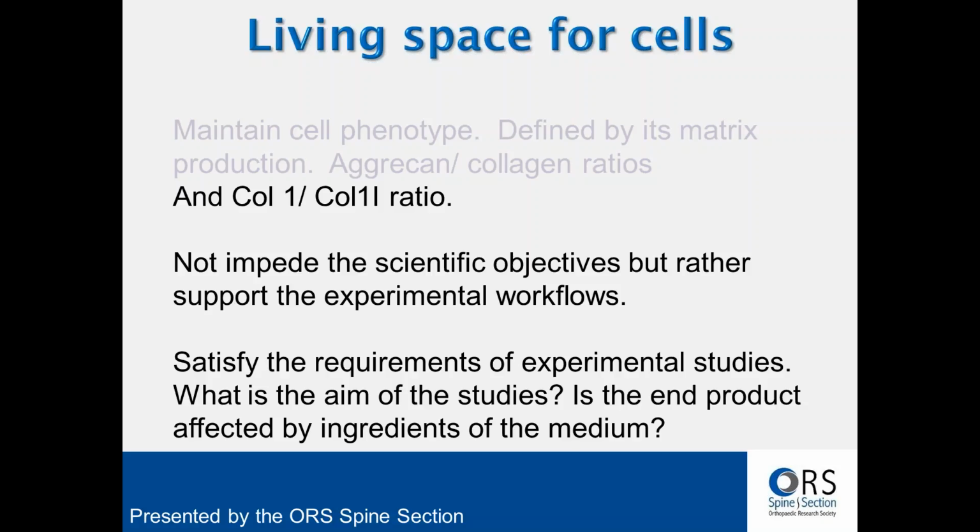The other important thing is that the media should not impede the scientific objectives, so it should support the experimental flows. What I mean by that is something that I talked about before, which is basically that if you are going to expand your cells, which you have got from biopsy, your media should not inhibit cell proliferation. This is very, very important. It should satisfy the requirements of the experimental studies. What is the aim of the study? Is the end product affected by the ingredients of the media?